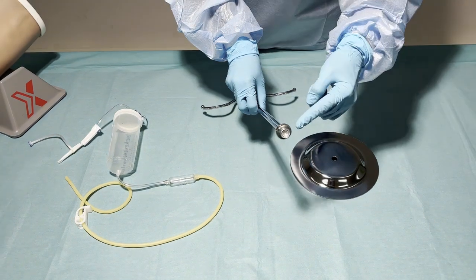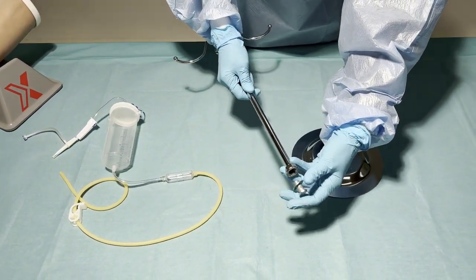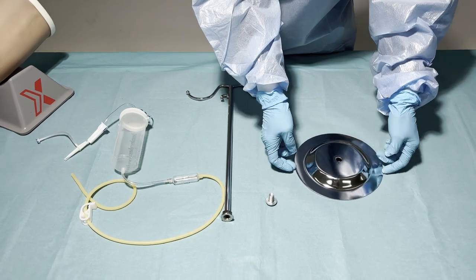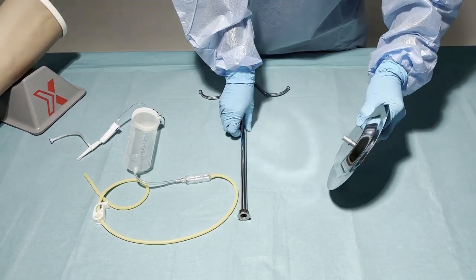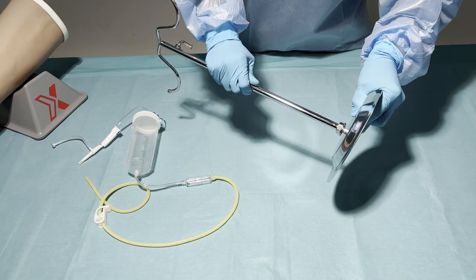First we take the stand and unscrew this part. When the screw is unscrewed, we can put it through the foot or the base of the IV stand. And then we hold it in place and screw the stand on top of the base.